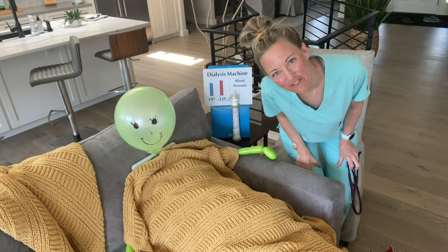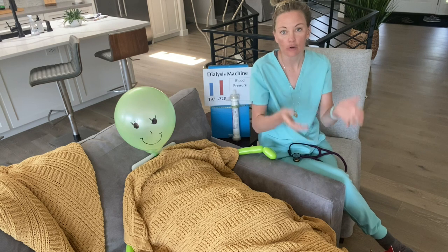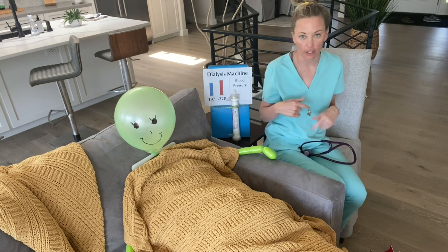Hello and welcome to the clinic floor. First thing you do when you bring them into the unit is you get your weight and then you bring them to their dialysis chair.